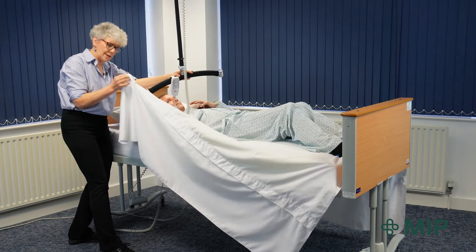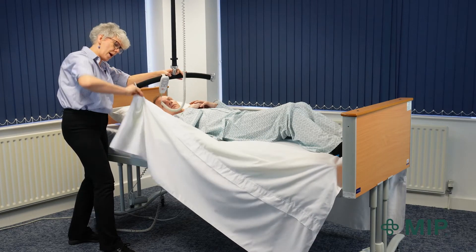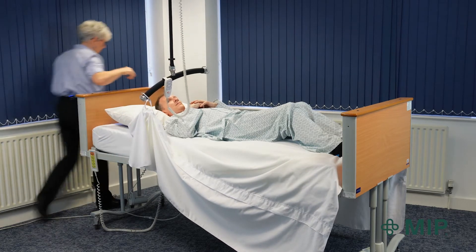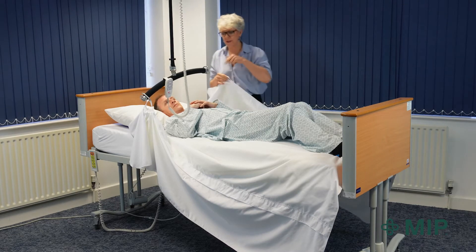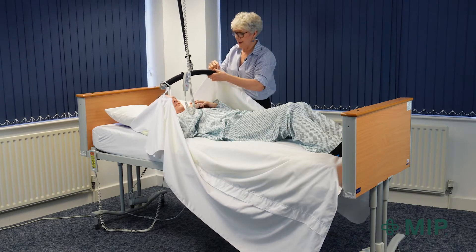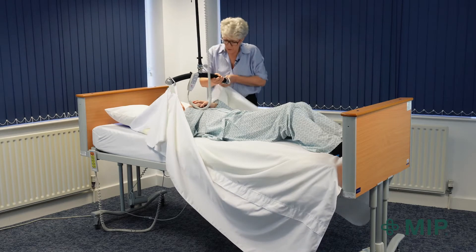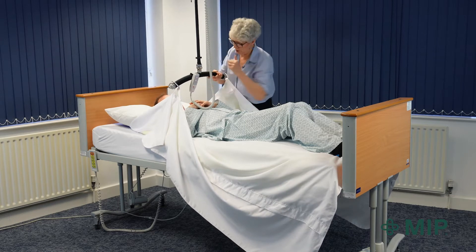First of all we're going to hook the handle up to the hoist. I've chosen a handle quite high up, about level with his shoulders. I'm just going to come around to the opposite side and do exactly the same on the other side, making sure that the handles I'm using are the same height both sides. I'm also going to make sure that I'm using the same loop on the hoist.